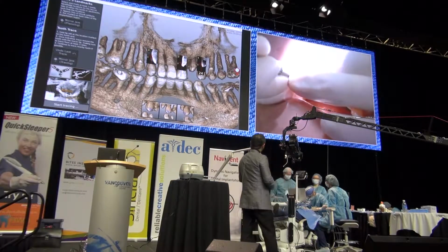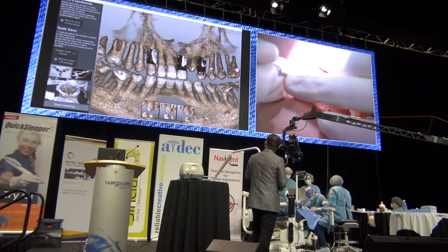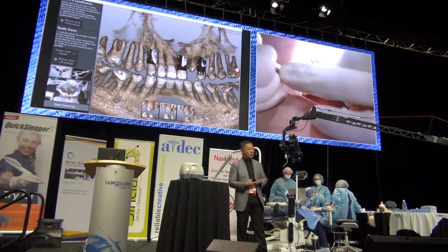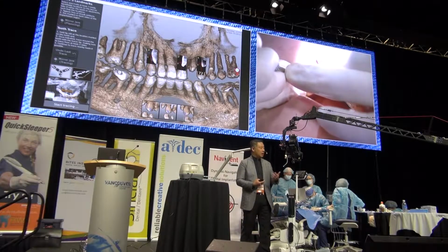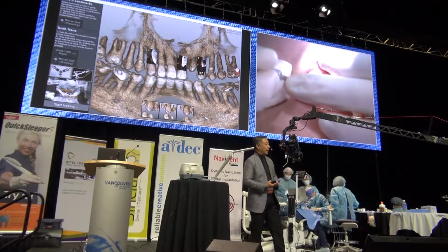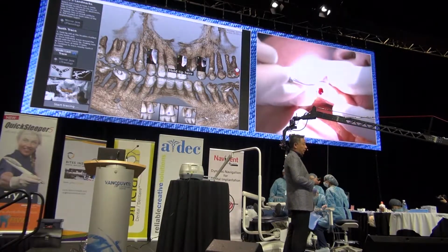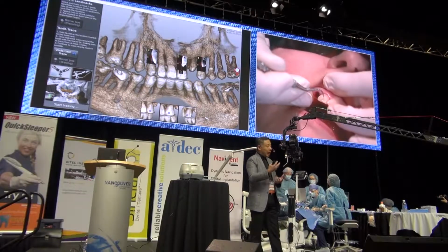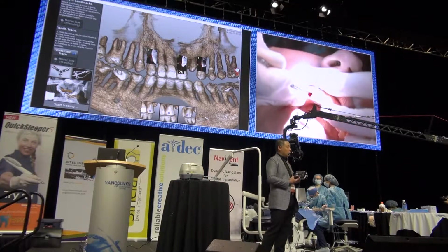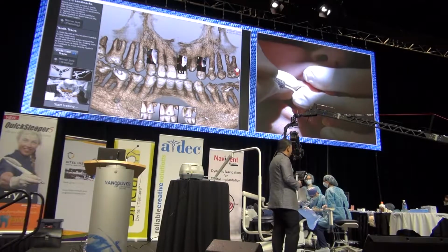So now we're going to start putting markers in to evaluate. These were the markers we were talking about that we will not need in terms of the extraoral facial fiducial markers. Now with the existing scan, if the patient's being referred or already has an existing cone beam, you can utilize that. Before, we would have to do another scan at an imaging center. We needed to image again because we need to have a marker on that area. So what they're doing now is picking 3 teeth to give an intraoral scenario for the markers to get us prepared for the osteotomy.